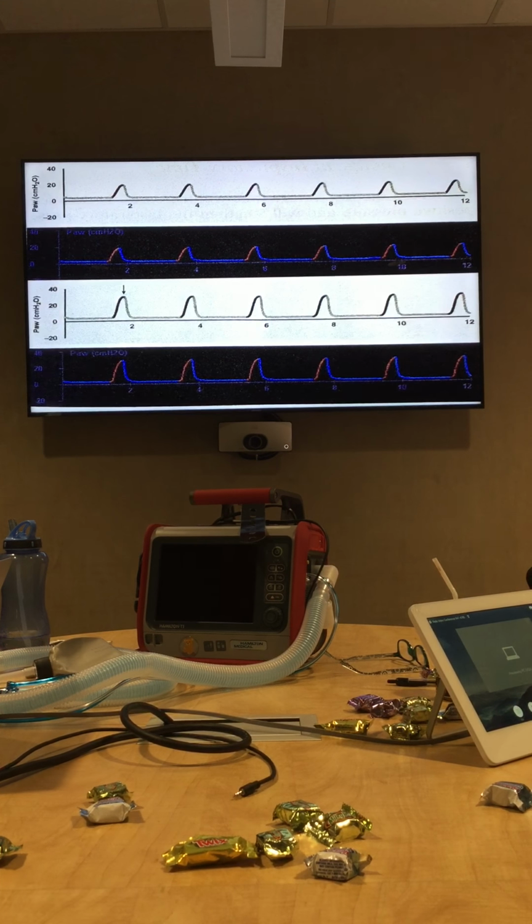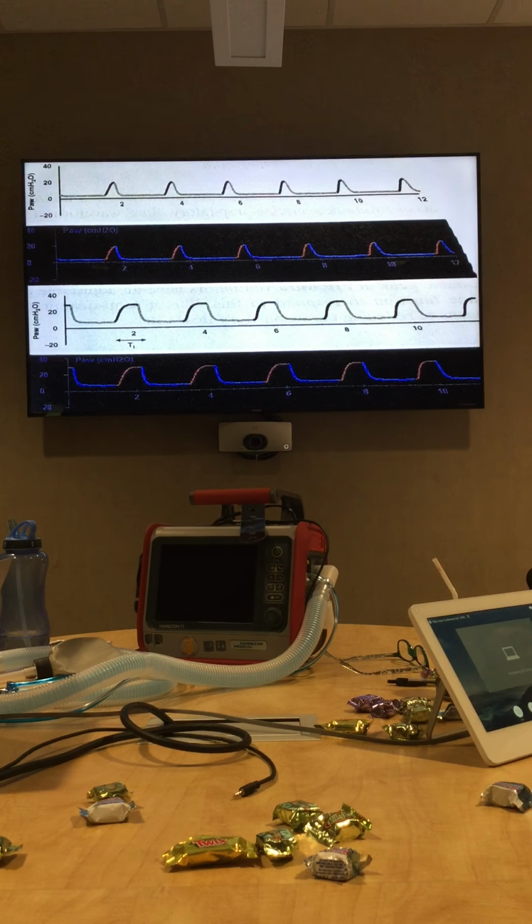In fact, if I just give a patient PEEP by itself, or put them on CPAP, that may do that just by itself, because that positive pressure is just enough to decrease that resistance, whether it be from a pulmonary vascular resistance standpoint, okay, or a cardiac standpoint.